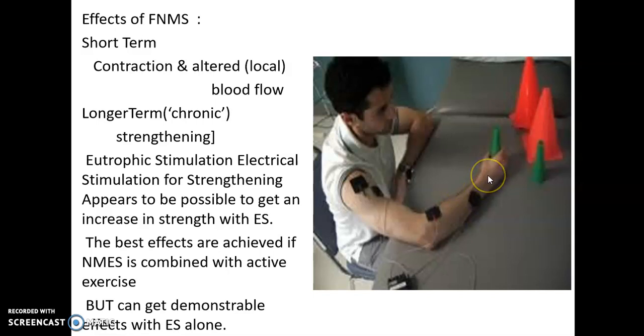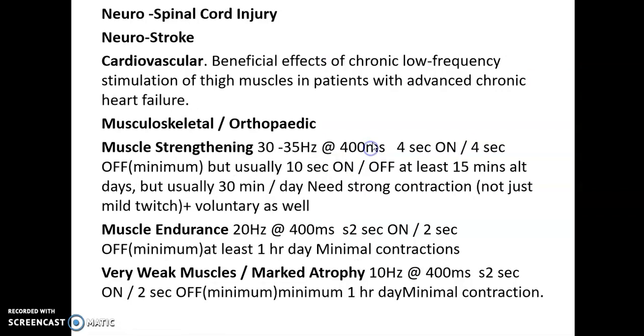The main benefit of functional neuromuscular stimulation, or FES, functional electrical stimulation, is mainly to improve voluntary activity. So active exercise along with stimulation. That means both physiological stimulation and artificial stimulation are combined. That is a major benefit of using FNMS, whenever the person is an active participant. Already we have understood that somatosensory cortex activation is also happening.